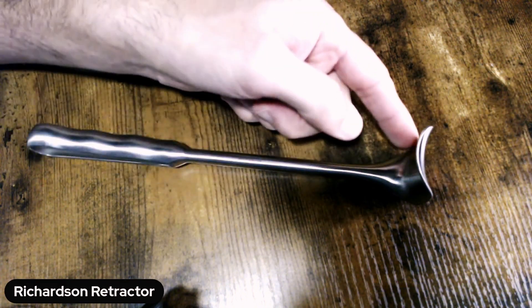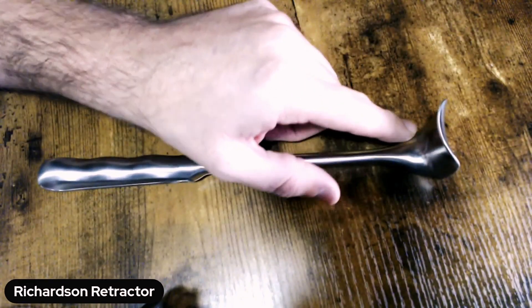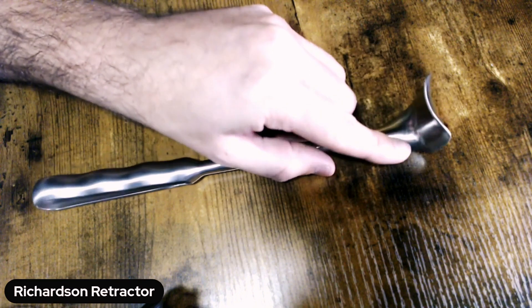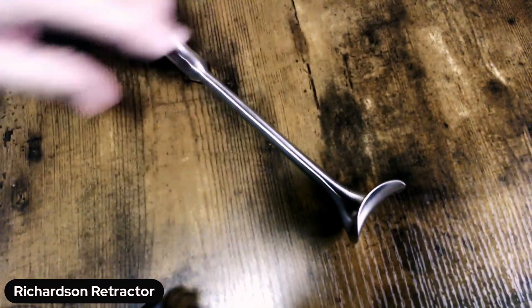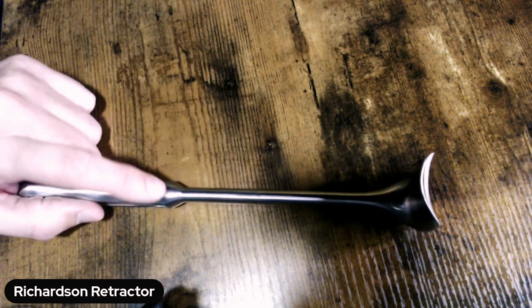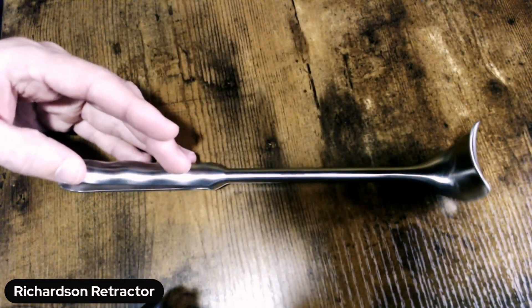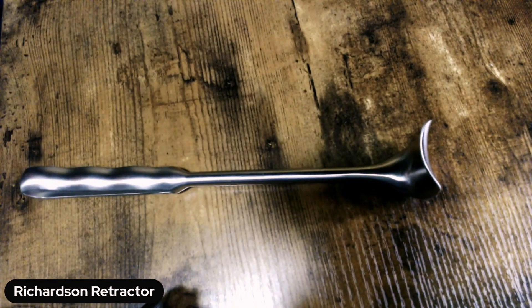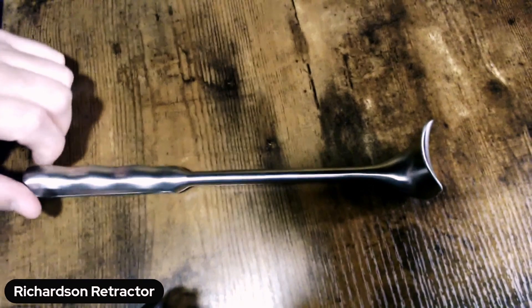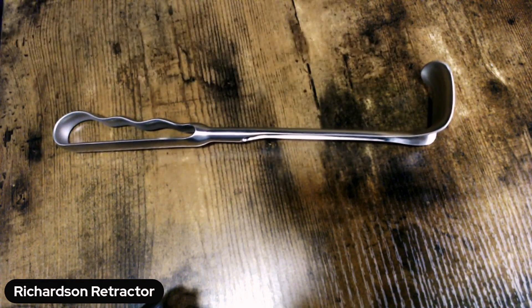As you're inspecting, we've got length that we want to be concerned about, which should be included on the count sheets. You've also got the depth of the retractor blade and the width of the retractor blade as you look at it from the top. Once you've identified it as the correct device, your final step — in addition to making sure the handle is clean — is to examine this distal tip for any chips, cracks, ridges, or burrs. It's very easy for these to get little notches during use, so take a close look all around the outside of your Richardson retractor blade prior to processing in the assembly area.